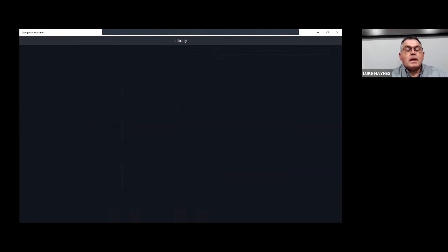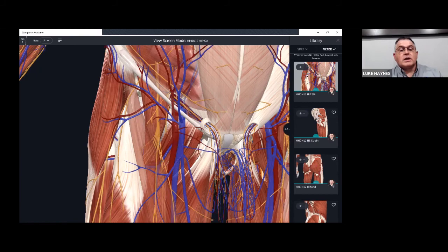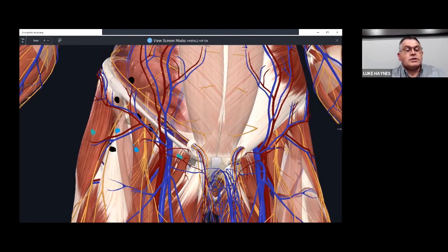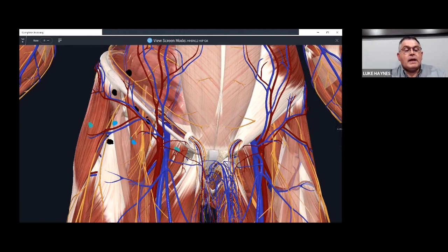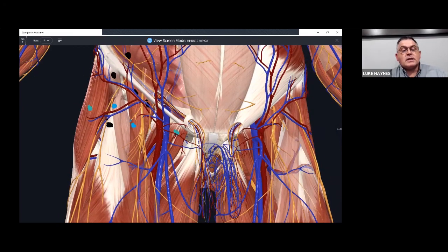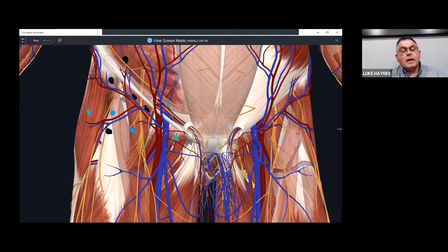All right. And the biggest thing we want to be cautious of is our neurovascular structures. So anytime we're needling here, be cautious. Sartorius is hidden, where it's faded, it's still here. Anything inside the sartorius, adductor longus, inguinal ligament, here in our femoral triangle, we want to be very cautious. It's not to say we have to stay away from it, but we want to be cognizant of what we're dealing with. Again, we always palpate for pulse from the femoral artery.